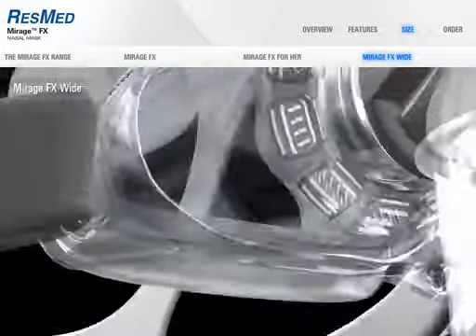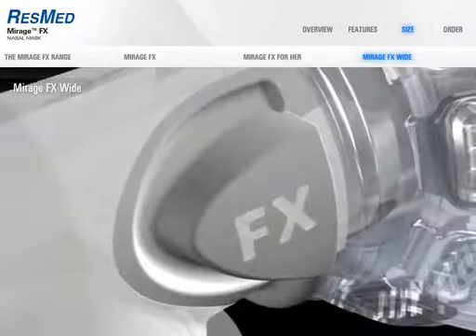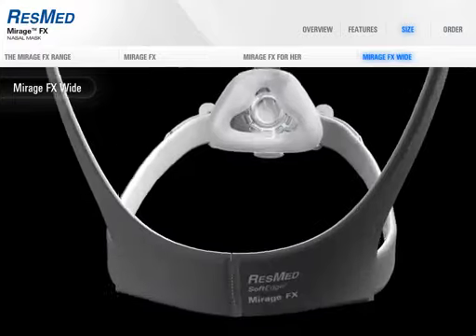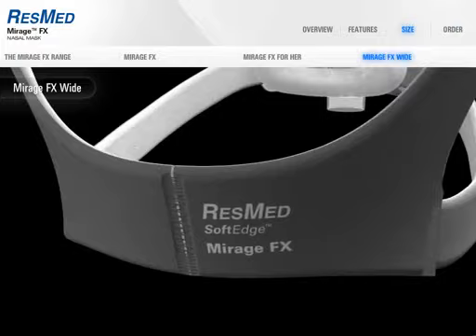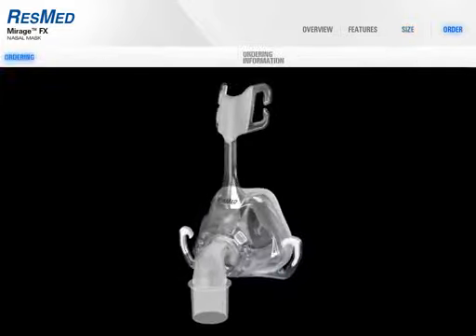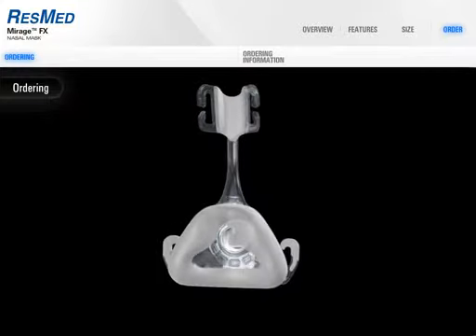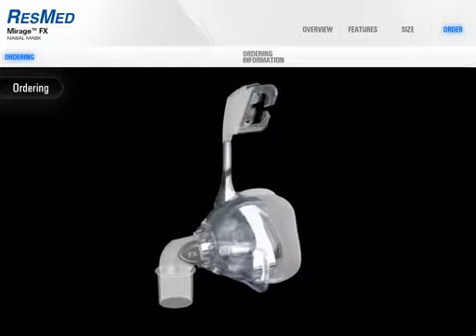Mirage FX Wide caters for those with wider nasal features. It comes with the wide size Mirage FX cushion, wide size Mirage FX frame, the squeeze tab elbow, and ResMed's new soft edge headgear. The Mirage FX Wide still offers maximum comfort in a minimalist, unobtrusive mask. The perfect balance of sophisticated design and easy functionality, Mirage FX is the solution you've been waiting for — performance, ease of use, and quality all rolled into one.